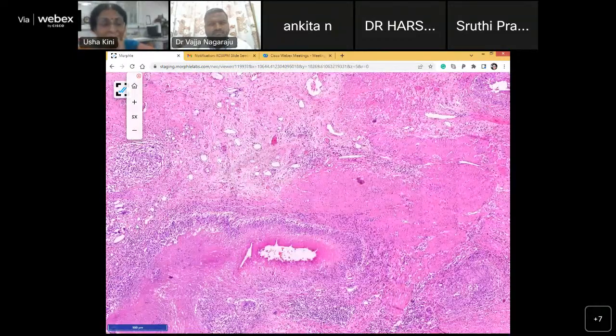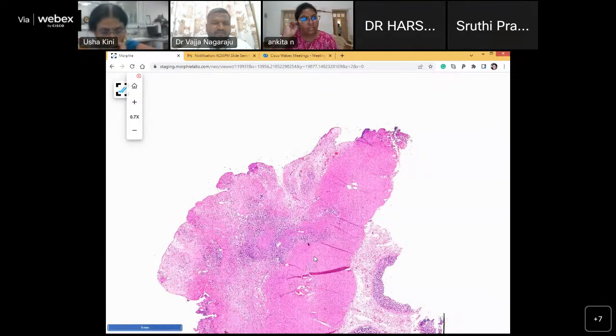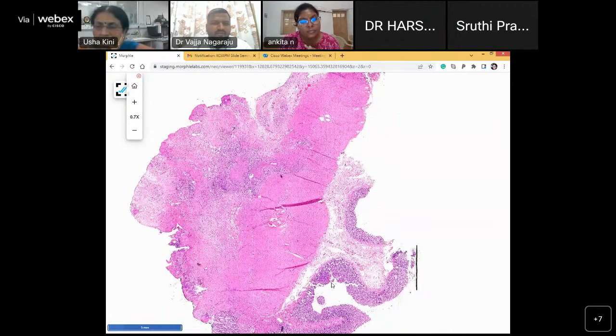Do you agree, Ankita? Nagraj, what do you say? Vasculitis, I don't think, madam. What do you mean by granulomatous colitis? Where should the granulomas be in granulomatous colitis?